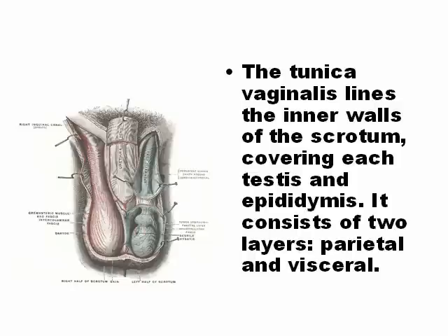It's the same peritoneum that came with the testicle when the testicle left the abdominal cavity and entered the scrotum. And for that reason the tunica vaginalis, as peritoneum, has two layers, the parietal that is covering the scrotum and the visceral that is around the testis.